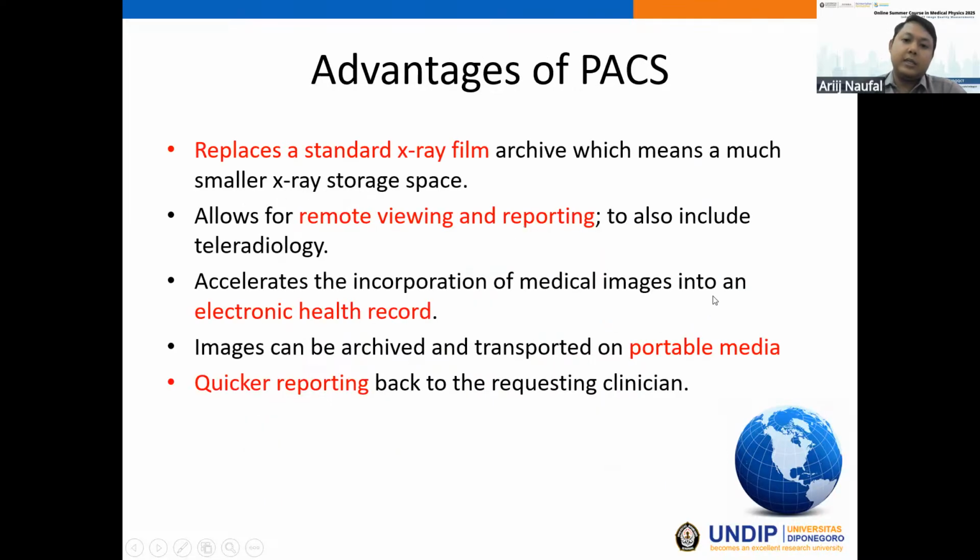Okay, next is advantages of PACS. Why we use PACS for modern imaging facilities. The PACS can replace a standard X-ray film archive, which means a much smaller X-ray storage space. Usually each PACS system can be configured to store a certain period of images. For example, 5 years in the past, and beyond the 5 years, they are automatically deleted forever.